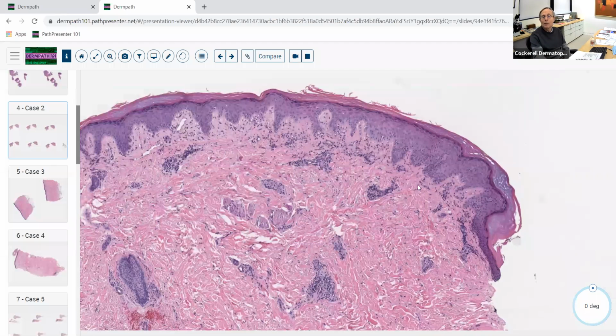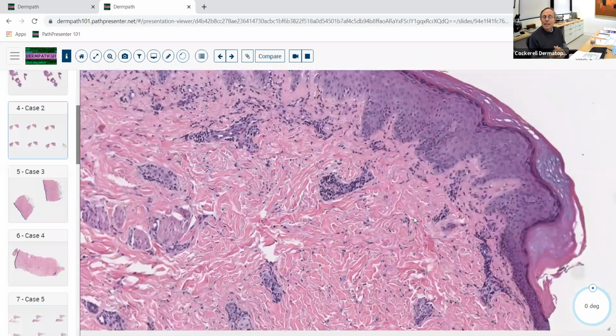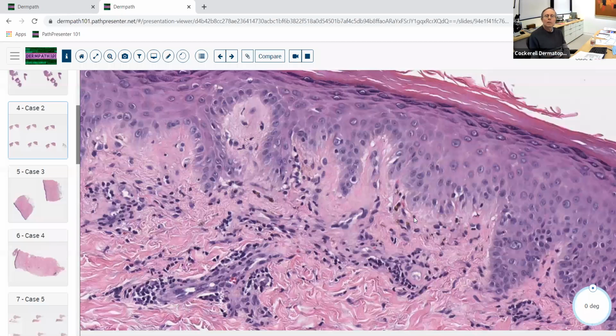with lymphocytes and vacuolar alteration: lupus erythematosus, and then its histologic identical twin, dermatomyositis, which can look almost identical under the microscope. Just like we think of pemphigoid and pemphigoid gestationis as histologic identical twins, you pretty much just go ahead and think of dermatomyositis and lupus, usually subacute lupus and acute lupus, as being histologically almost identical. It's tough to tell them apart most of the time.